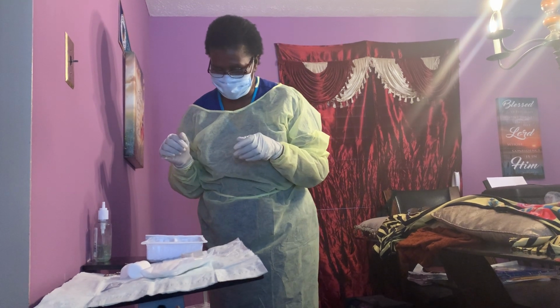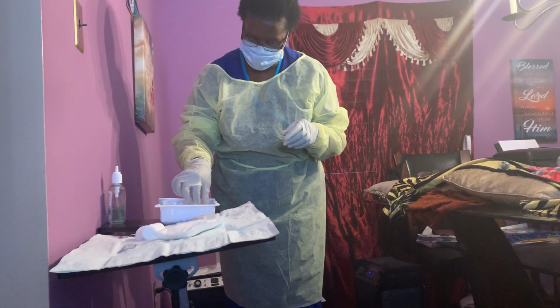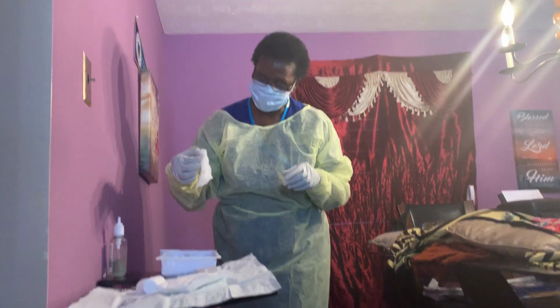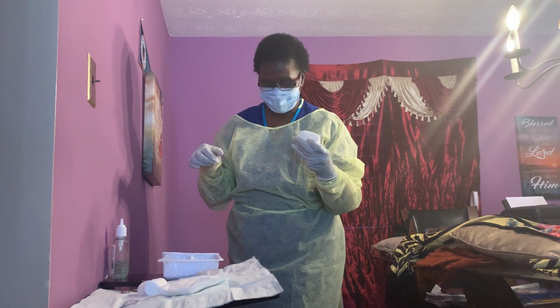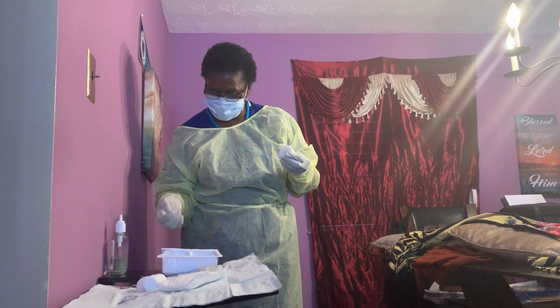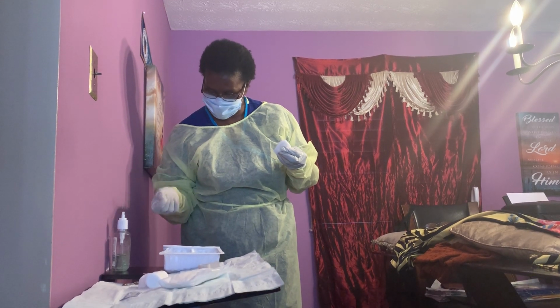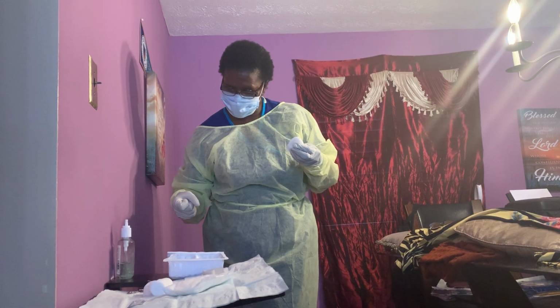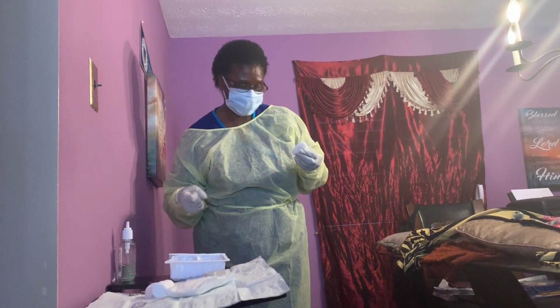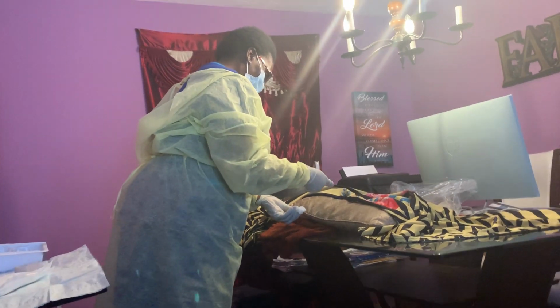So before that, I'm gonna use my sterile hand to pass it to my clean hand, and then I take the syringe with my sterile hand, because the syringe is sterile from a sterile container, I assume. And then I'm gonna withdraw 35 to 60 ml of water, and then I will irrigate the wound.